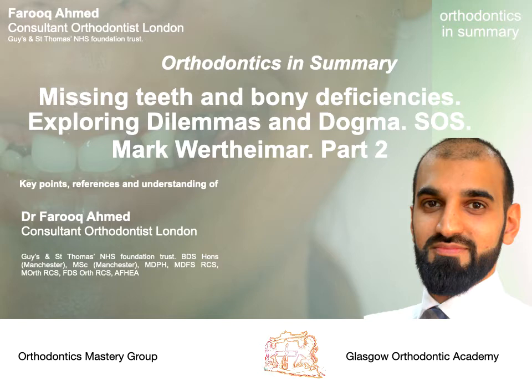Mark spoke about his preference of using a lower left 5 bracket and having it inverted, i.e. for the dot to be positioned incisal on the canine. This bracket achieves, with the MBT prescription, a plus 17 degrees of torque. It is also contoured to allow it to adhere to the canine tooth itself.